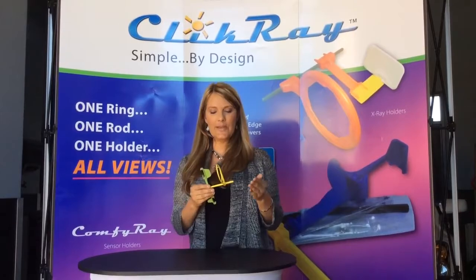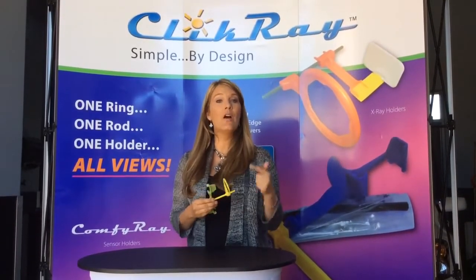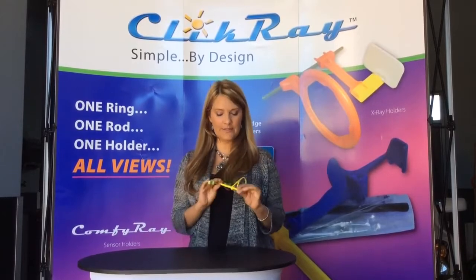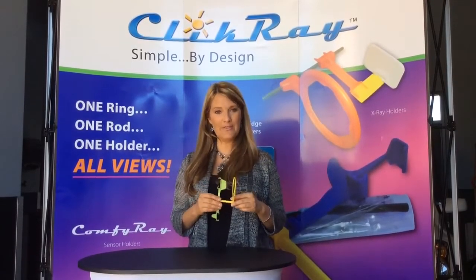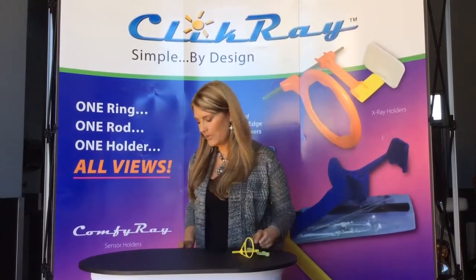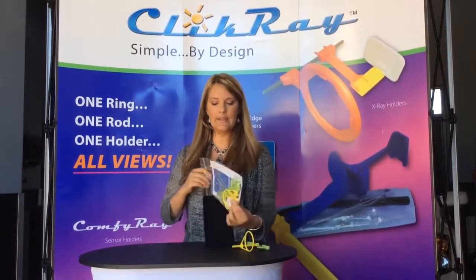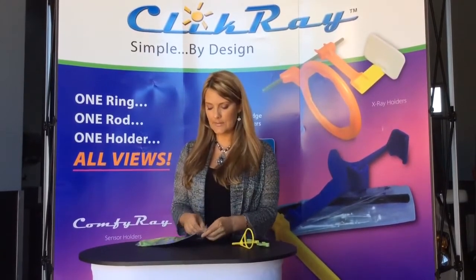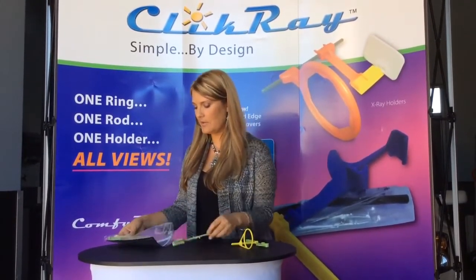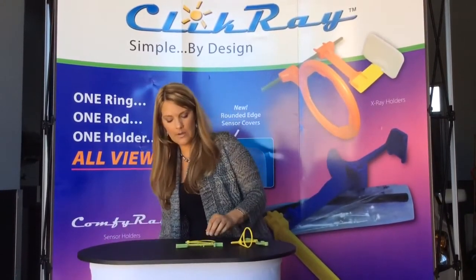With the ClikRay systems, we have one ring, one rod, and one holder for all views. With this little system, you can take an entire full mouth x-ray without having to have all those different parts and pieces. So when you get your Dexis system, it's gonna come in a bag that looks just like this. There's two systems that typically come in a bag or in a pouch. And you're gonna take out one ring, one rod, and one holder.